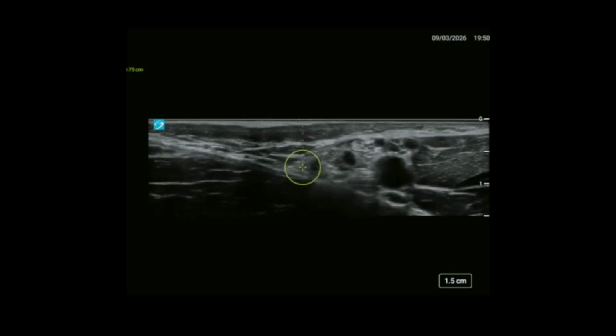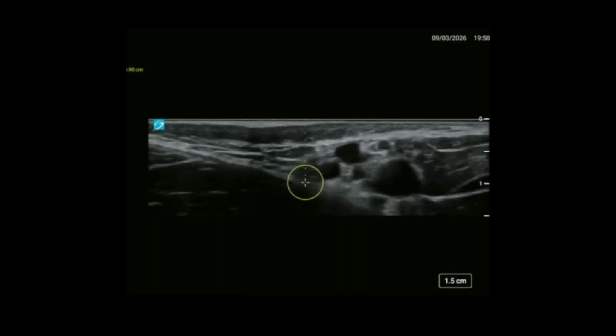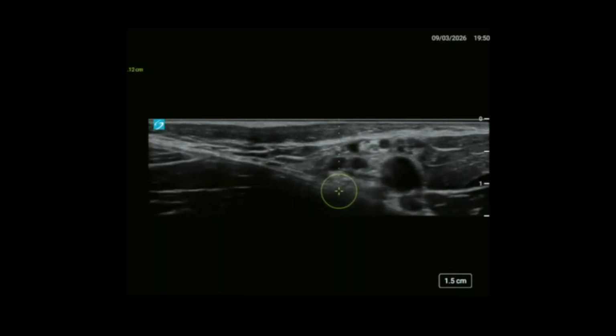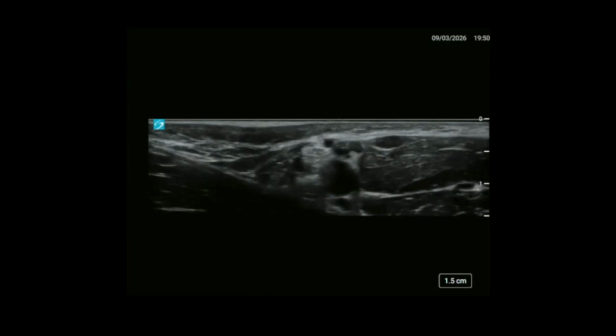So I would look to put local here and here, and just get around all of this. If you can't see it, just deposit in the area of the tail. And to do that, we've got to get there.